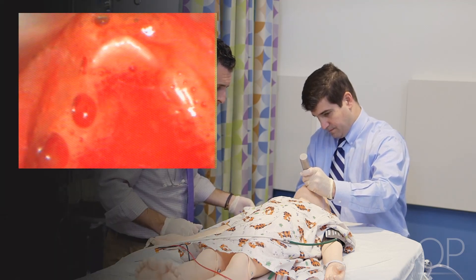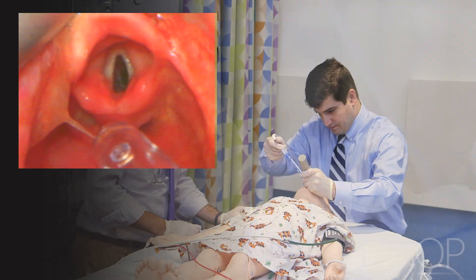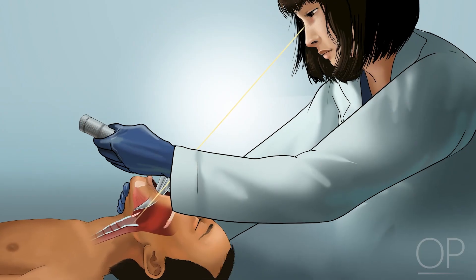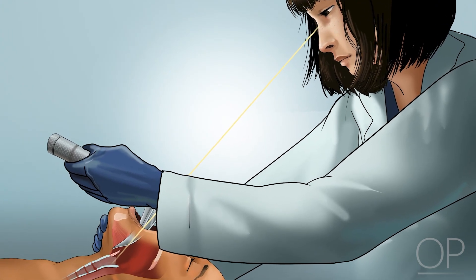If secretions block the view of the vocal cords or the glottic opening, suction should be used to clear the view as needed. Once the glottis and the vocal cords are visualized, the provider performing the intubation should maintain the laryngoscopic view.